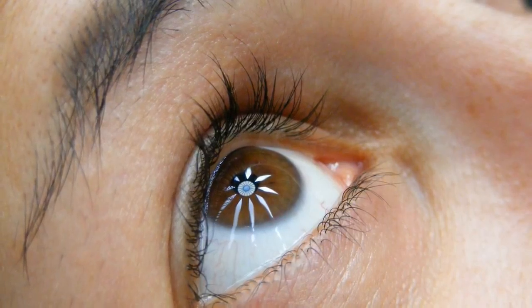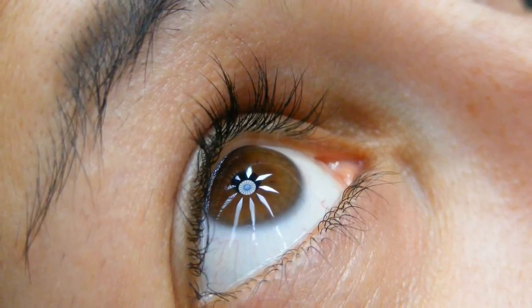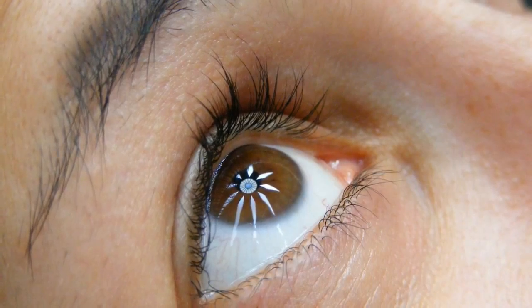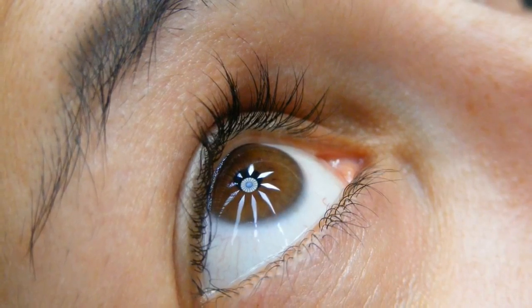In contrast, the new lens is curved in such a way that projects images across the entire macula, offering unparalleled all-round vision.